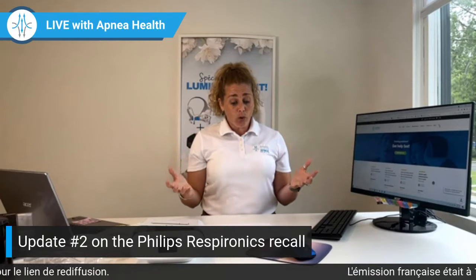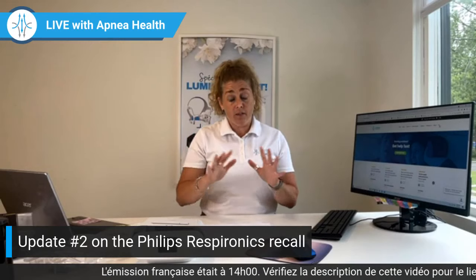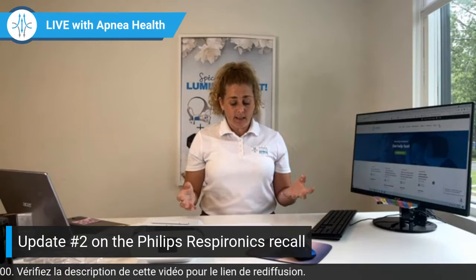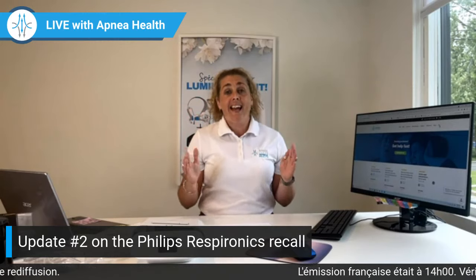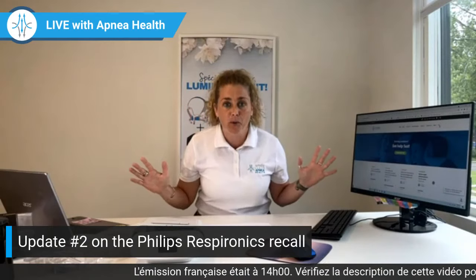Okay, for those who don't know, on June 14th, Philips recalled all of its CPAPs built from 2009 to now. So the problem is the foam in the device that allows the soundproofing. Hashtag foamgate. My gosh, my mind's gonna explode.